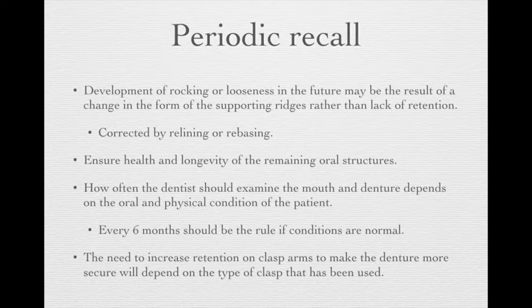After the 1 month follow-up, if no issues happen, the patient might think their RPD treatment is already finished. However, that's not the truth. They should have a periodic recall over life. The reason is we have to prevent or correct some errors that might happen in the future. For example, rocking and loosening might happen in the future because of supporting ridge resorption.